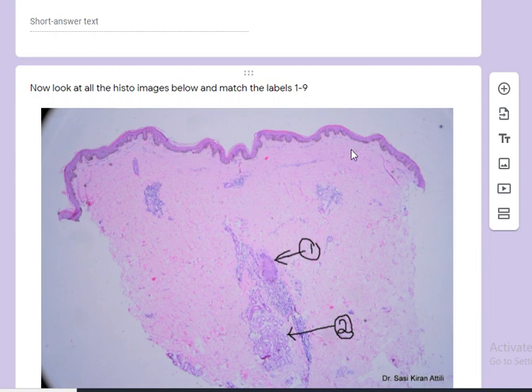And this could be one of two things. This could have been a hair follicle which has been destroyed, or it could have been a sort of subtle interface dermatitis which was there previously, which has now disappeared, leaving a bit of effacement of the rete ridges, or just simple dermal sclerosis when it's quite prominent. It also affects the inflammation; whatever caused the dermal sclerosis can also affect the interface sometimes, causing effacement of the rete ridges. This is the hair follicle, obviously, which is in the process of destruction.